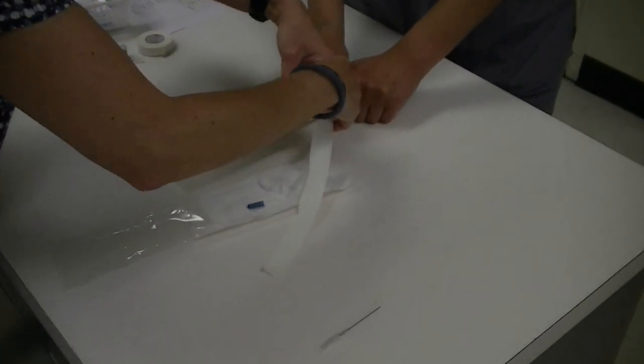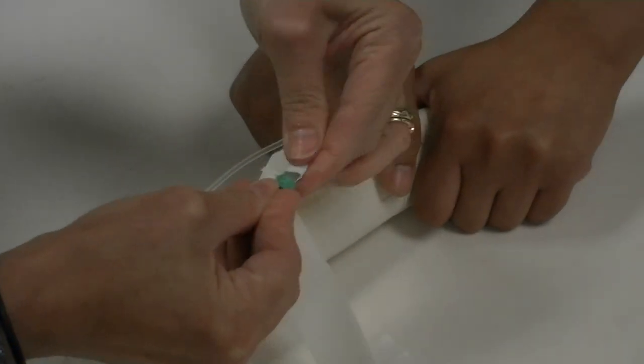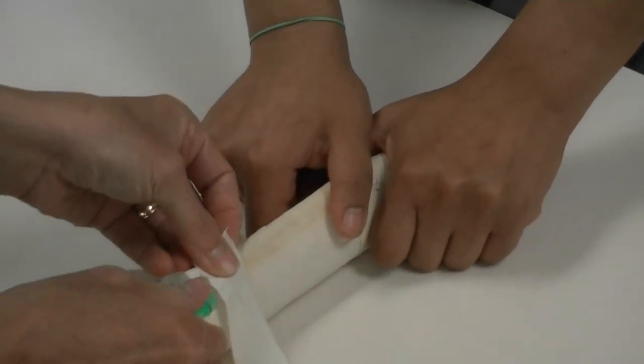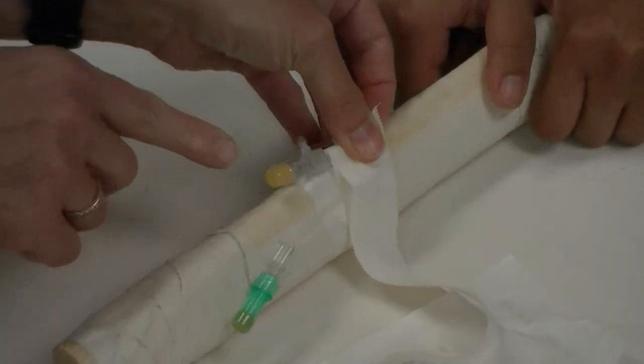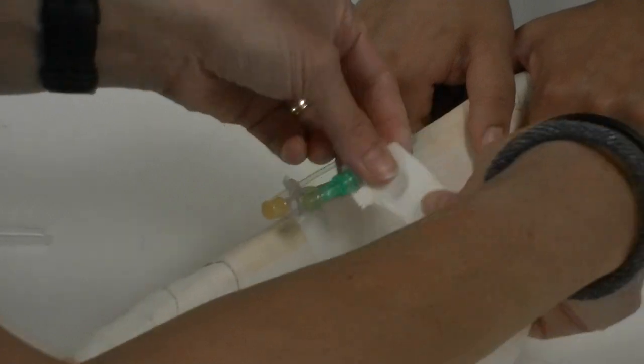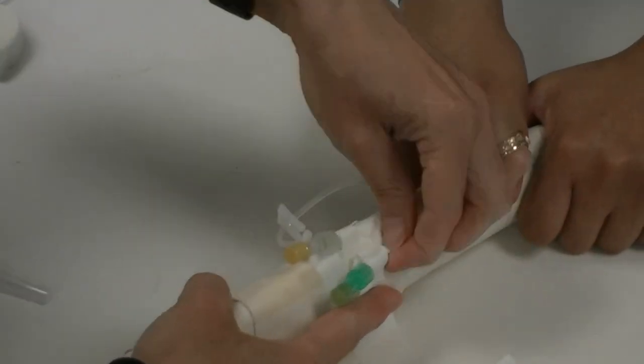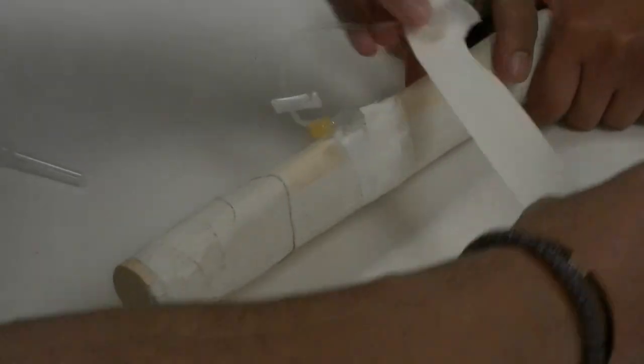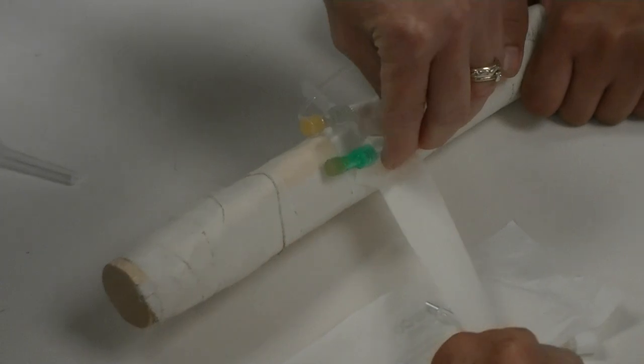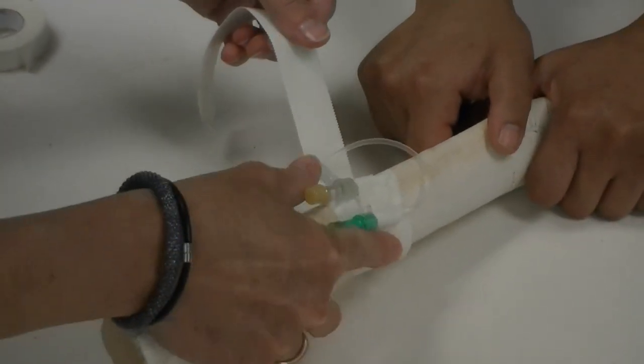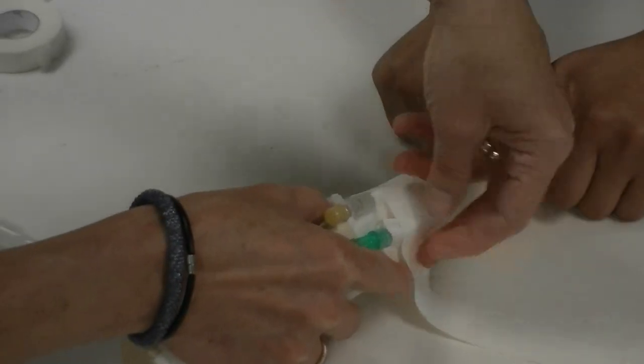I'm going to take this one-inch tape and attach it to the T-port first. I want that totally stuck down onto there, because I want to avoid—if I do just this method—if there's pull on this, it'll eventually slide out, and that's going to cause occlusion on my catheter. So I'll stick that to the body of the catheter. Depending on positioning of the patient and length of the leg, I can adjust it how I need to without creating any kind of occlusion. It may need to go facing upward. Generally, in most patients, it can go facing downward, unless it's a dachshund—the leg might be too short to do that.